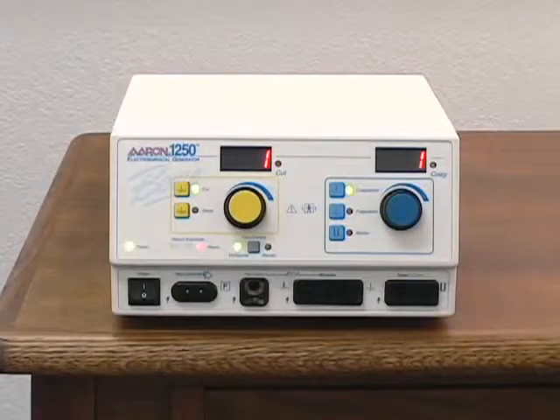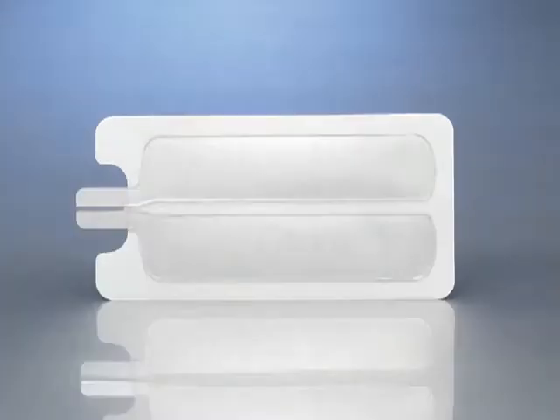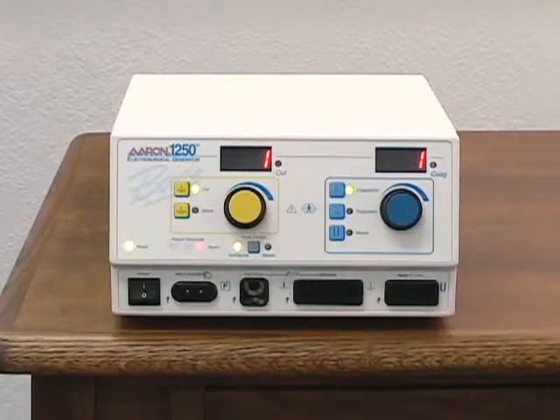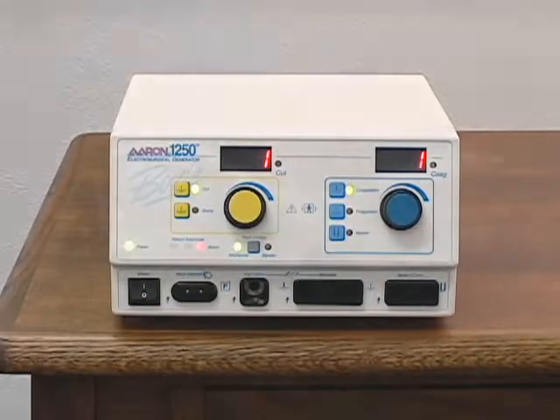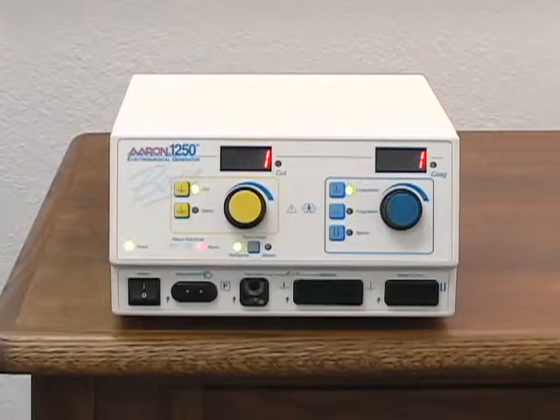The Aaron 1250 is an isolated unit, and all monopolar modes require the use of a grounding pad. Grounding pads are available in a variety of configurations: solid pad only, solid pad with attached disposable cable, split pad only, and split pad with attached disposable cable. Pads without cables are to be used with the reusable grounding cable. The Aaron 1250 is packaged with a reusable grounding cable and five disposable split pads.